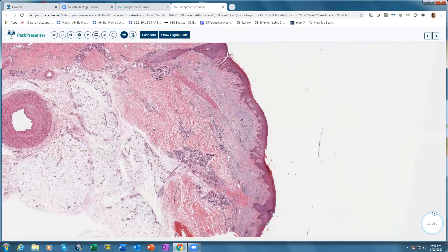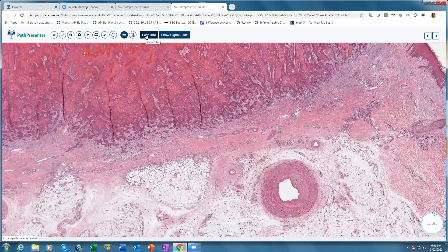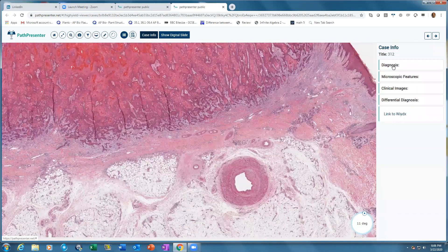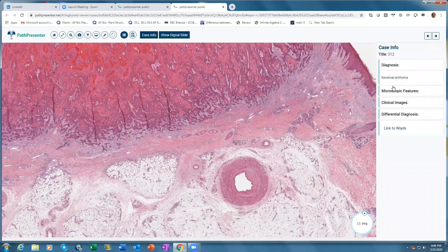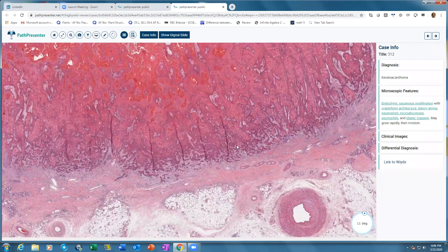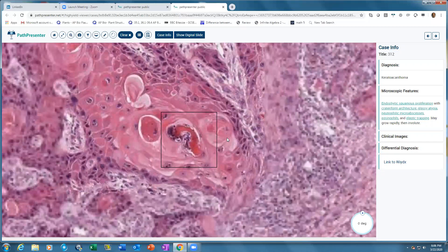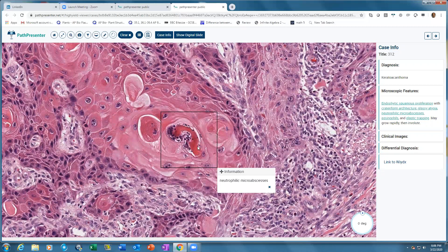Once you have made up your mind about the diagnosis, click the button that says Case Info. It will give you the diagnosis — keratoacanthoma — and the microscopic features. The best way to teach is on a multi-headed scope where the pathologist points out features to the resident or fellow, and that's what we have simulated here. Click on any of the highlighted features, such as neutrophilic micro-abscess, and it will zoom into the slide and tell you what that feature is.